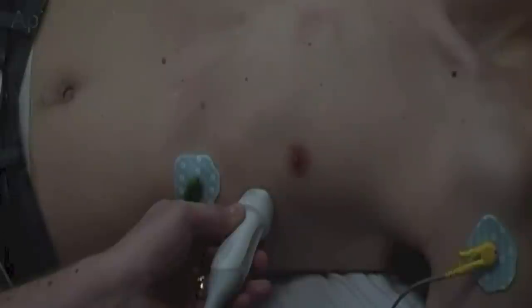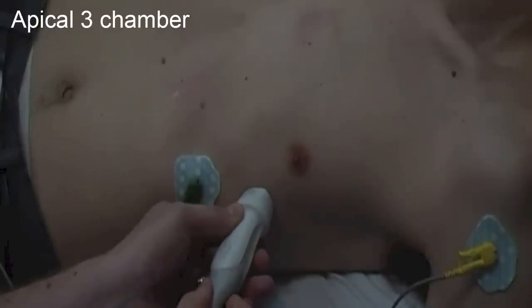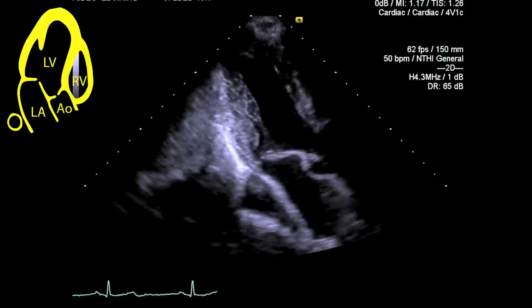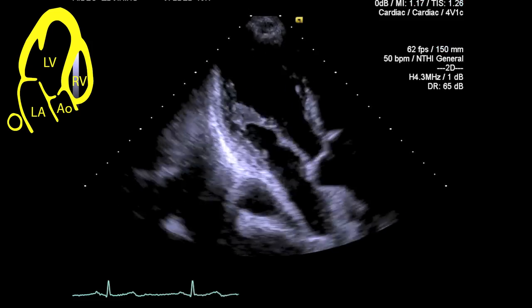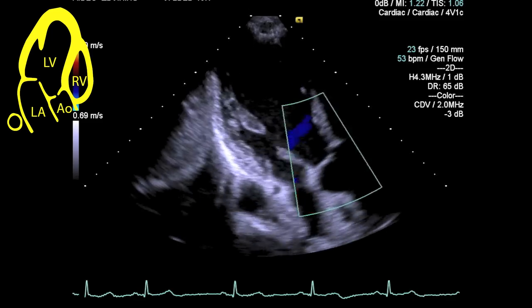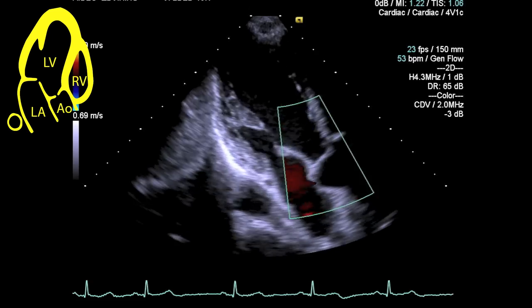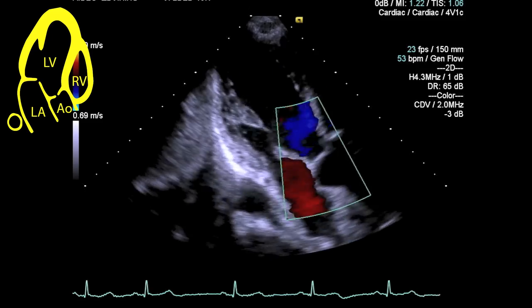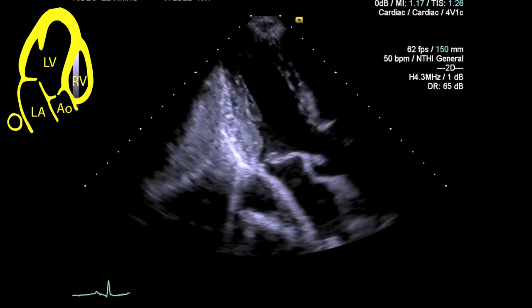The apical three chamber view is achieved by rotating the probe further in an anti-clockwise direction, with the probe marker ultimately pointing towards the patient's right shoulder. This is the same view as the parasternal long axis, however it's now viewed from the apex of the heart. Apply colour flow Doppler to both the mitral and aortic valves to assess any gross valvular pathology. The Doppler alignment is often more parallel in the left ventricular outflow tract from this view, and you may want to place a pulse wave Doppler in the outflow tract again to measure the stroke volume. Make an assessment of any obvious regional wall motion abnormality.